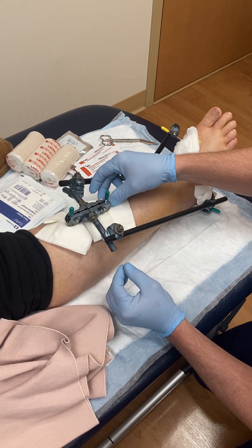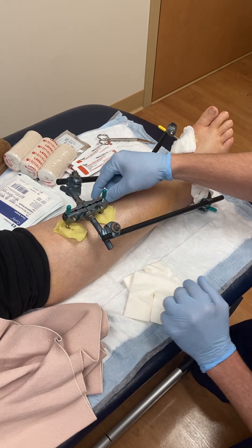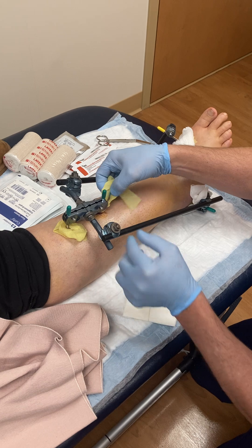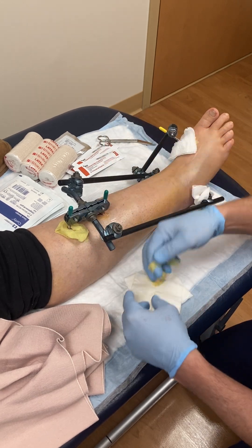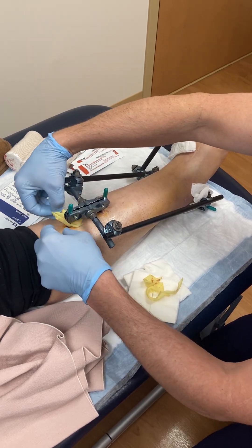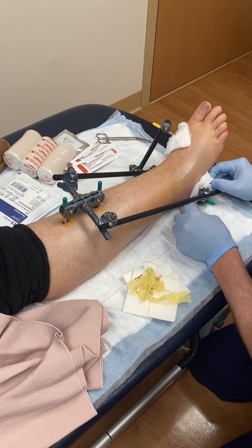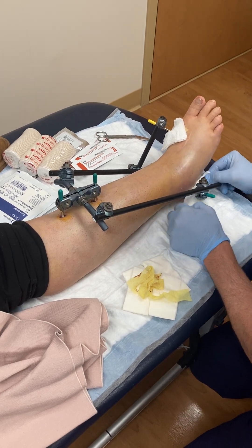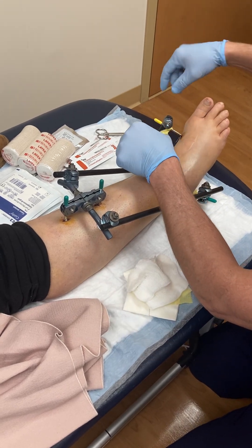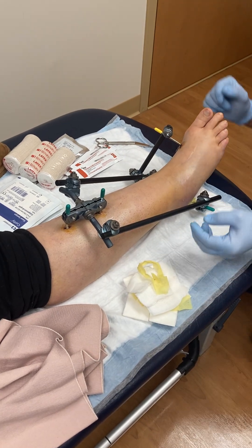This patient has so generously and graciously offered to let me do a little video so that other patients who have an external fixator can look on my website and understand how we go about doing pin site care. I've instructed her husband and a couple of her adult children to help with this, and they've done a wonderful job. I want to share this with other patients so they can likewise help their loved ones remedy this condition.